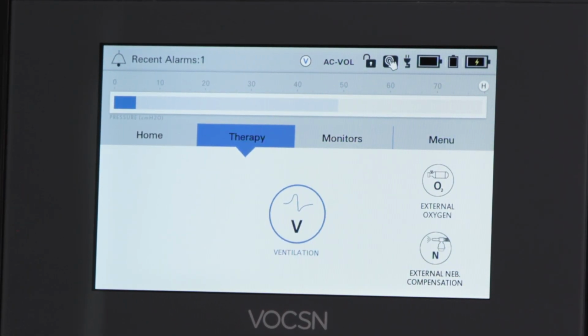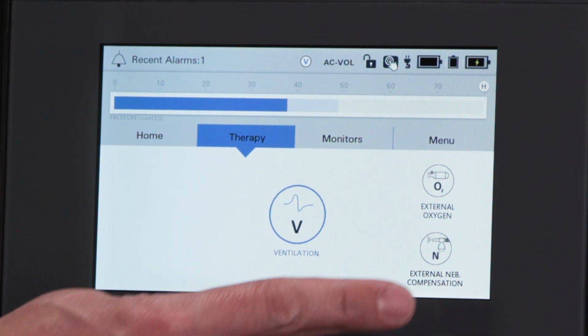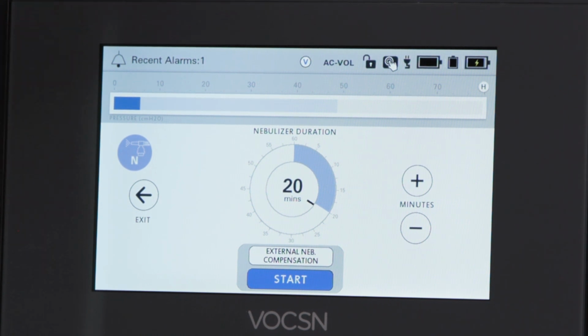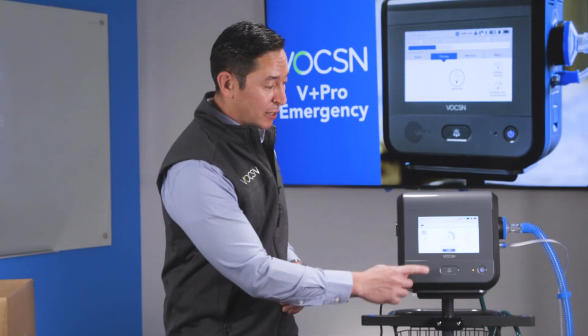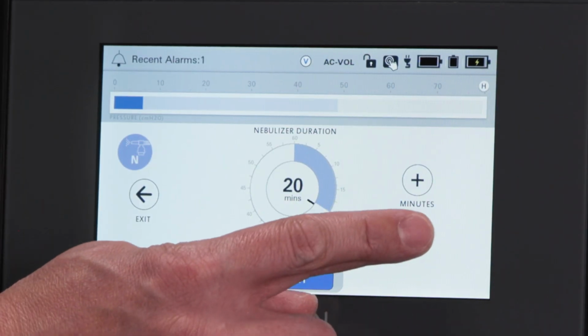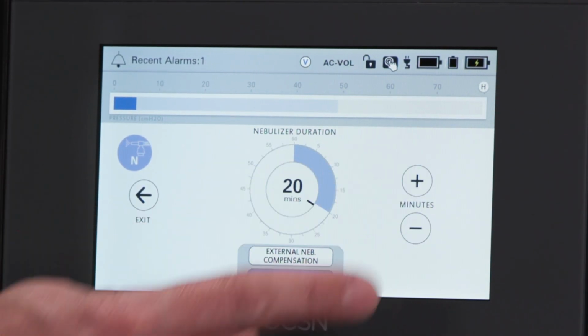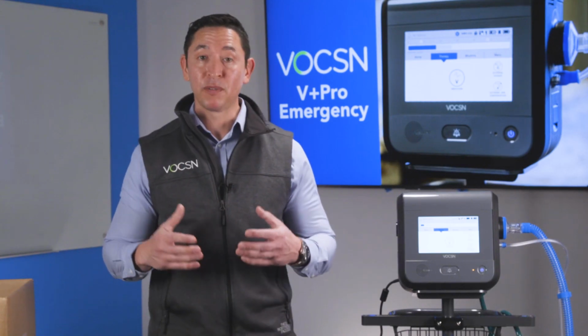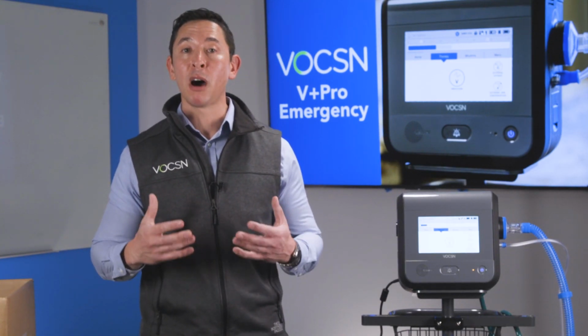And then our last therapy is the nebulizer therapy. Touch in for nebulizer. And this is where you have the capability to compensate from an external nebulizer source and deliver that nebulizer treatment to your patient. You can set the time duration for whatever you'd like by simply hitting the minus button or the plus button, and then just hit start. I can exit back out. So now we've given our therapies, now we want to monitor our patient.